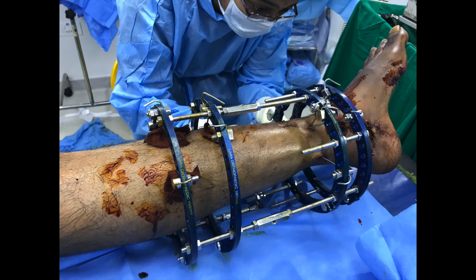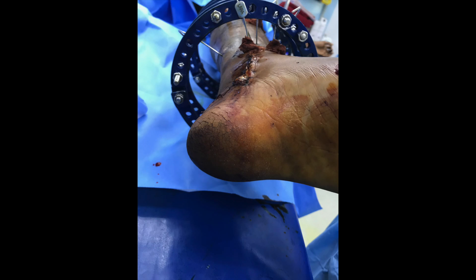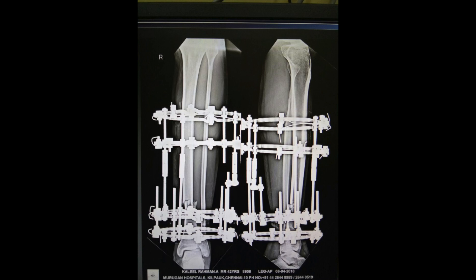Betadine-soaked gauze pieces are wrapped around all the pin tracks and the frame-limb junction is left free without bandages. The frame is then inspected inferiorly, superiorly, medially and laterally to see that the gap on all sides is uniform.